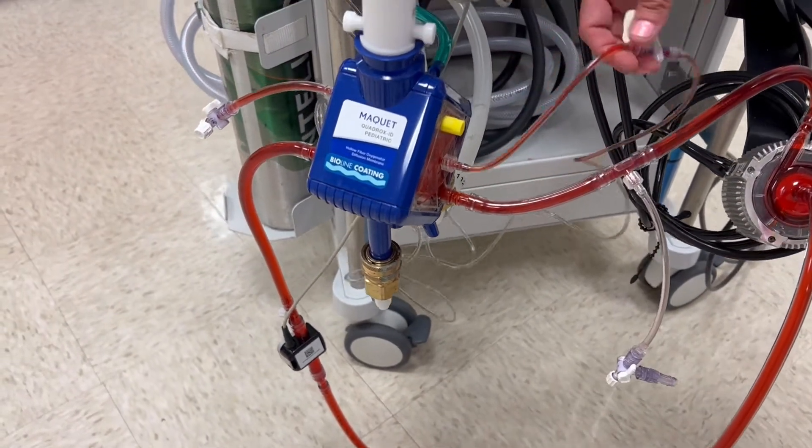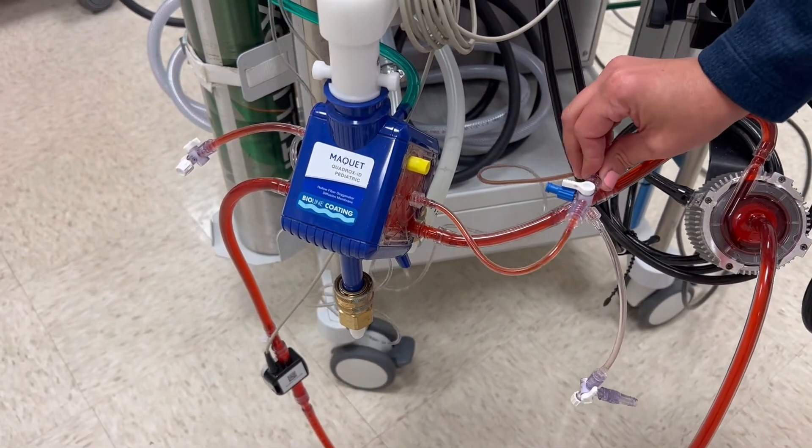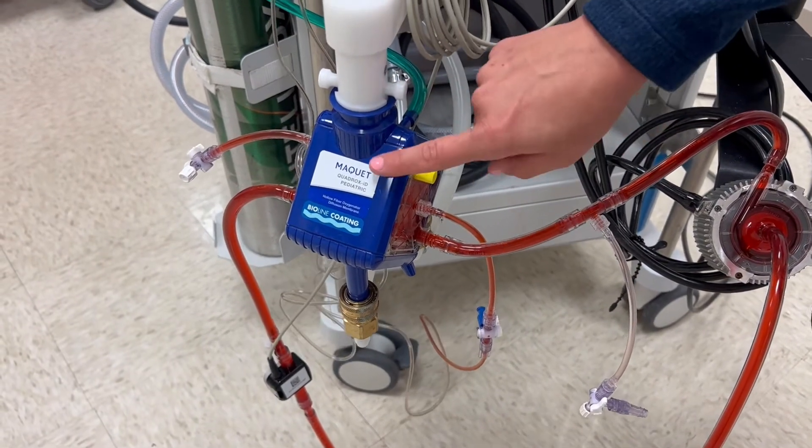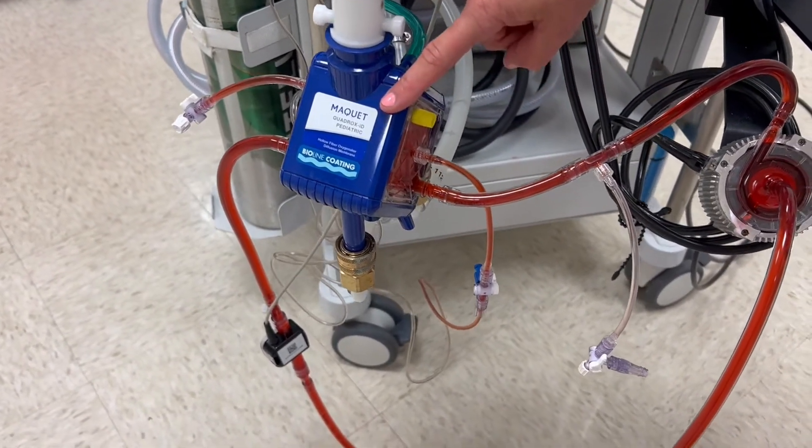Moving forward, we hit our first stop of a pressure line. This pressure line helps to monitor what our pressures are throughout the oxygenator, which is another main component of the ECMO system.